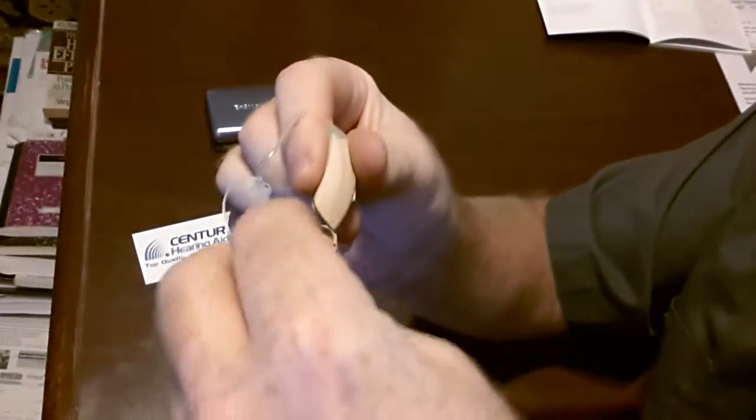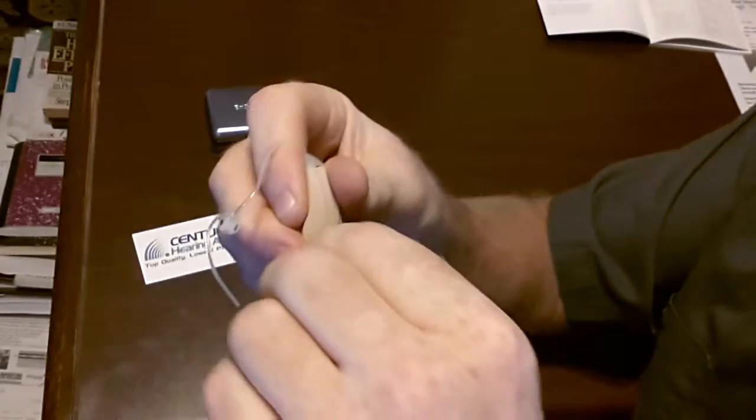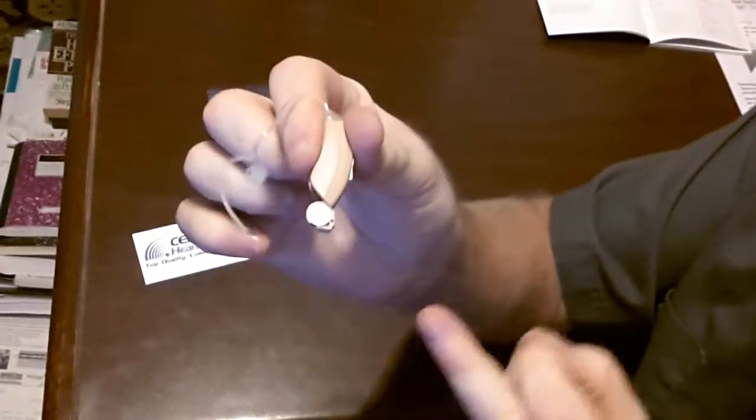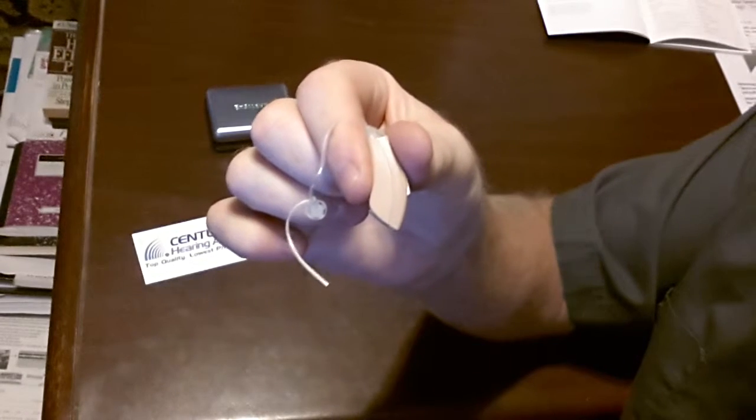Grab your new battery, lay it in with the tab up, pull the tab off and close the door and you're ready to wear your hearing aid.